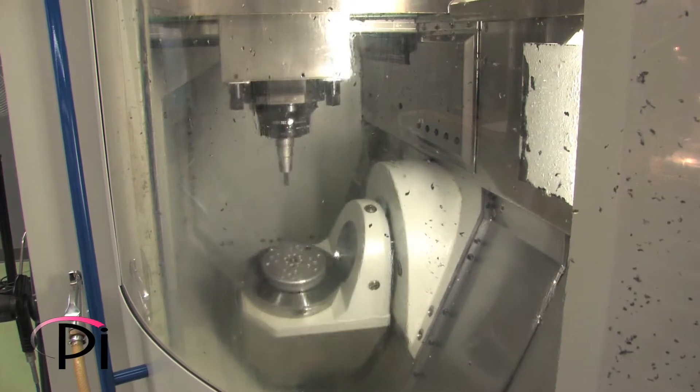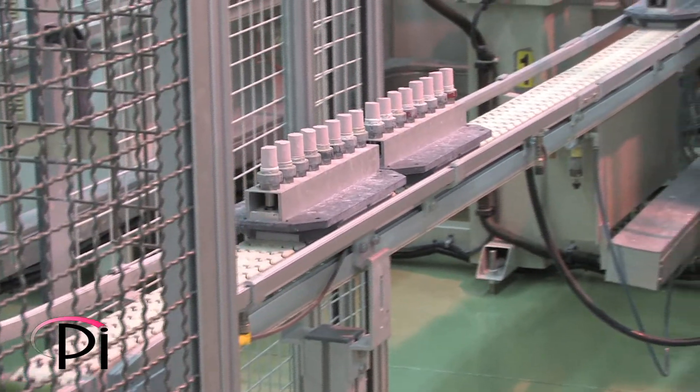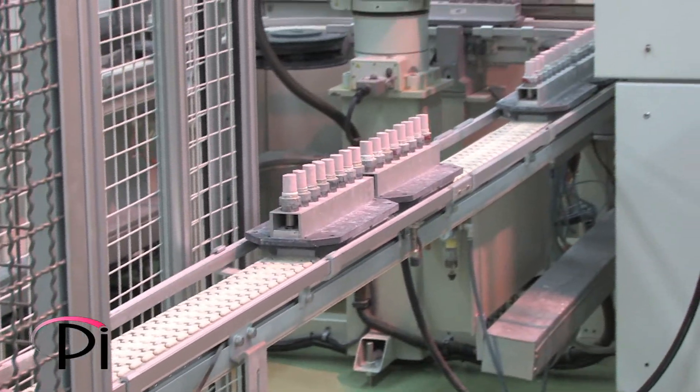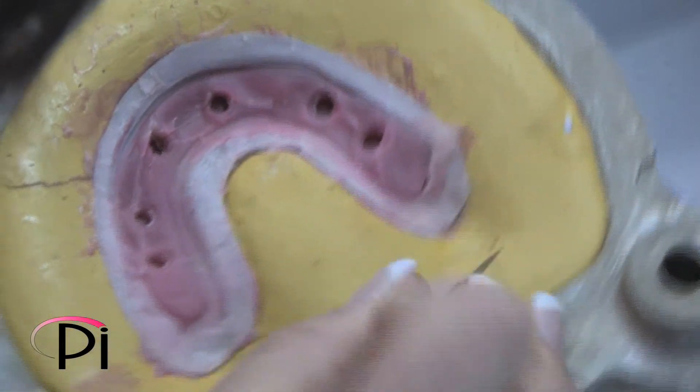For some partial and all total arch rehabilitations, a gum tissue veneer is also applied to give the prosthesis an unchanging natural appearance in relation to the biologic tissues underneath.